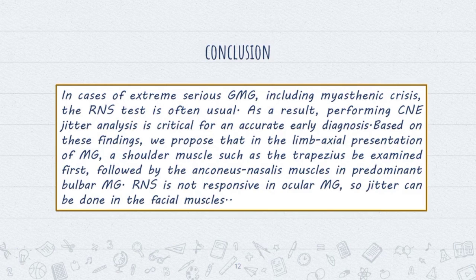RNS is not responsive in ocular MG, so jitter can be done in the facial muscle.